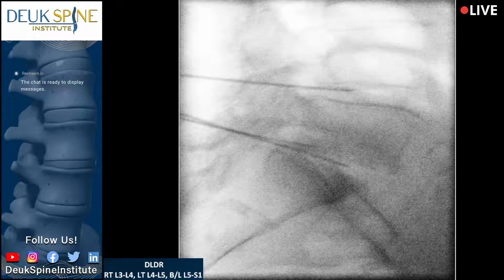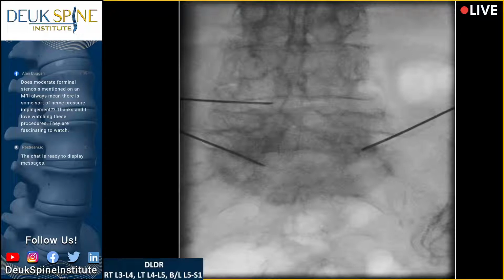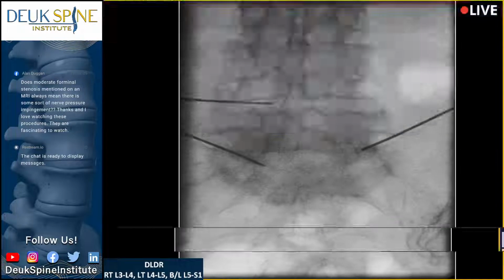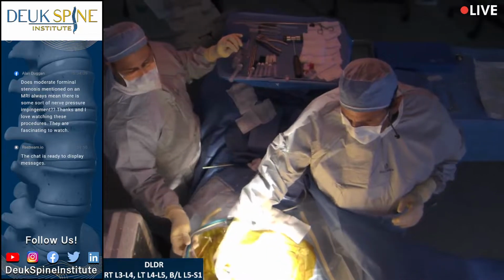So right now I'm talking to my team, particularly Jordan, and I'm asking him to move the X-ray machine around to different angles so that I can see where the needle is. The needle is basically going to be my guide to fixing these discs. The two of them on the left side are perfect. On the right side, I am right at the entrance, and it's starting to deflect a little bit up from the bone spurs. Yeah, that's what's causing the deflection, in case I haven't said it. The bone spurs are causing the needle to deflect.